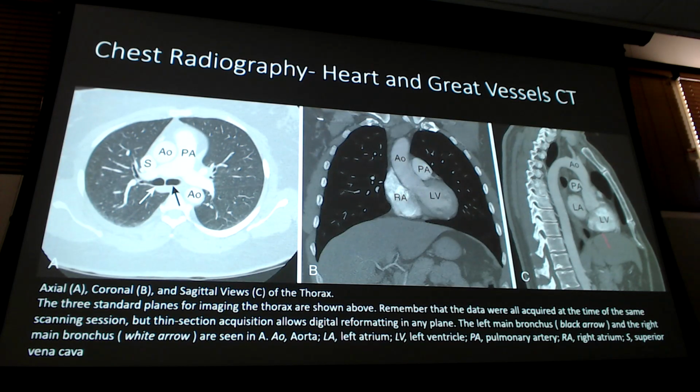Alright. Here's your sagittal slice to show you what it looks like, and your coronal slice to help you get an idea of the anatomy when you're scrolling through a CT. And what's key on this one, guys, is I had to give contrast for you to sort through these things, right? Because CT is a form of X-ray. So if we didn't give contrast, there is no way we're sorting through where that left ventricle goes up to the aorta or where the right atrium is at. It would just be one big gray blob. Does that make sense?